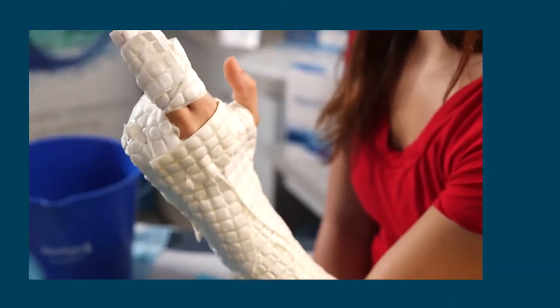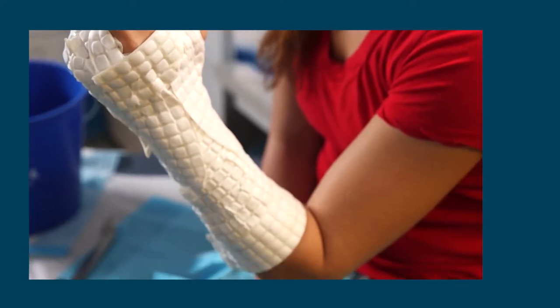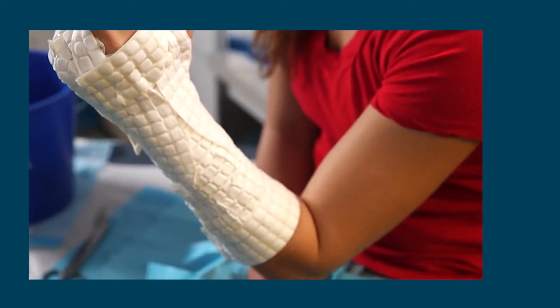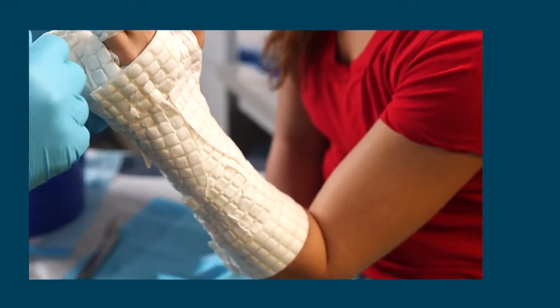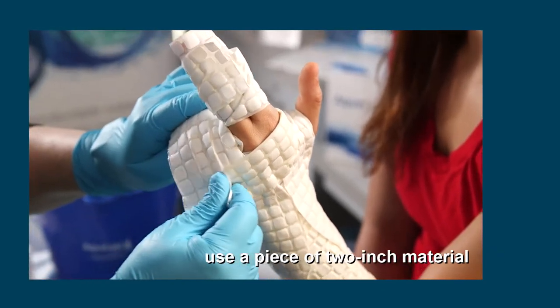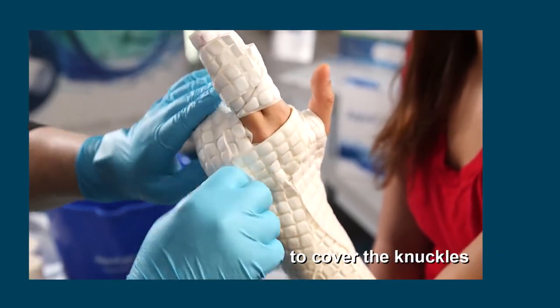Check the cast. Look for shadows and bony prominences. Use small pieces to patch them, adhesive side down. Use a piece of two inch material to cover the knuckles.